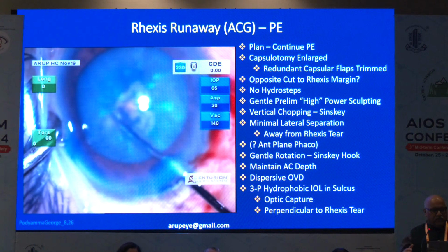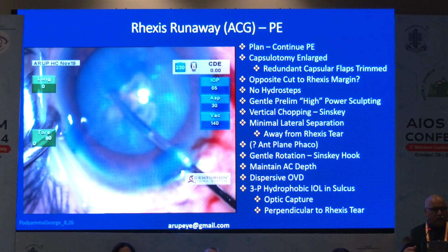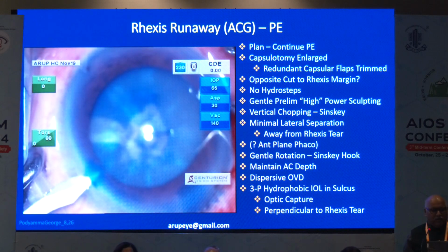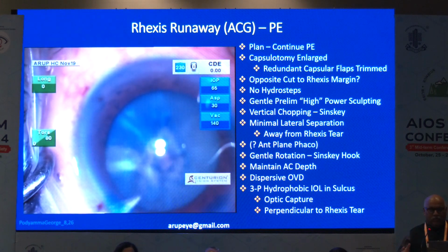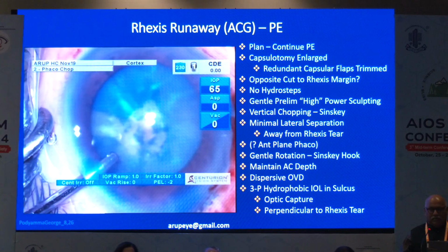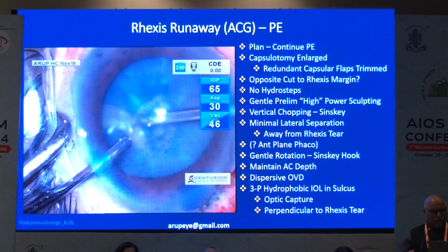At the first incision itself, if you see, when I gave the relaxing cut here, it ran to the periphery. So there was nothing that could be done to retrieve it. So I decided that I'd continue with phacoemulsification, though here the option was to do a manual SICS technique. I'm quite competent in doing it for the last 30 years.